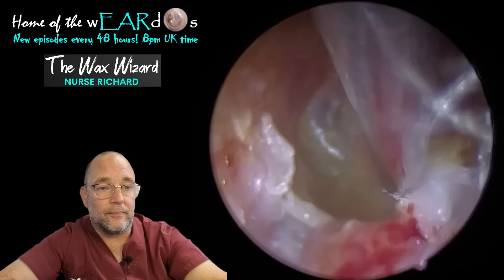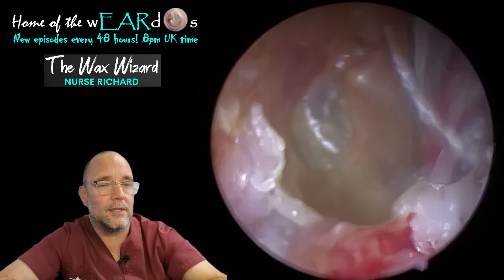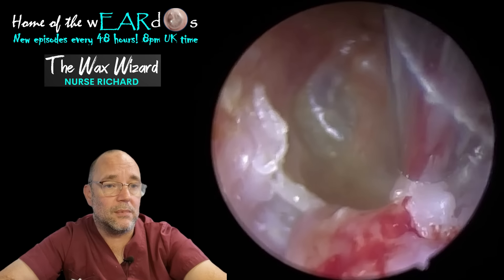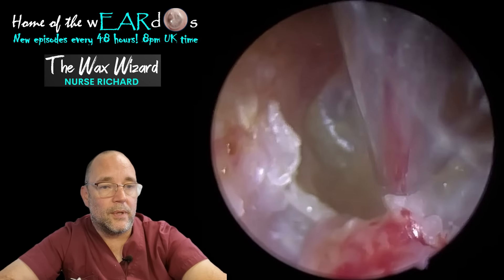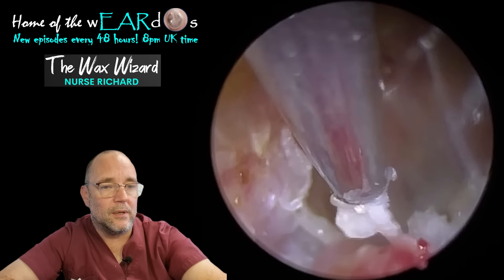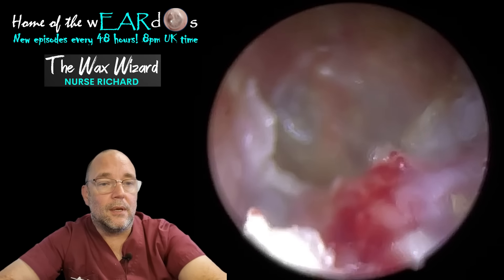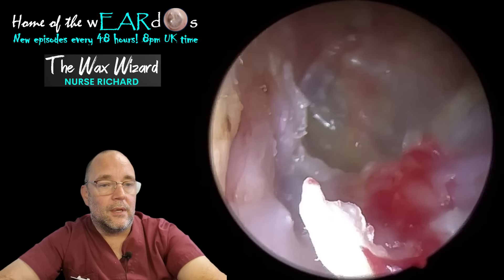You can also have necrotising otitis externa. Infection basically just breaks everything down. It is wet and soggy, so I suspect there's a bit of discharge at the bottom of the ear canal there - I'm not entertaining going down near the drum for that. I think this poor lady had been through enough without me going down there. So I think the cholesteatoma is the most likely one. But I have asked the doctor to cover her with some antibiotics, just to rule out any infection causing this, because it was so wet and soggy - chances are there either has been or is some infection lingering around in there as well. Obviously I've referred her as a matter of urgency to the ear, nose and throat specialists.